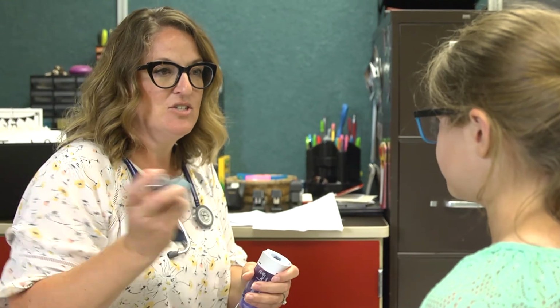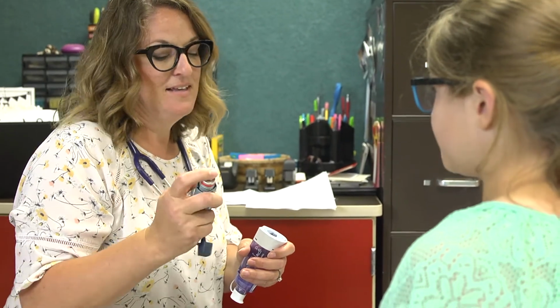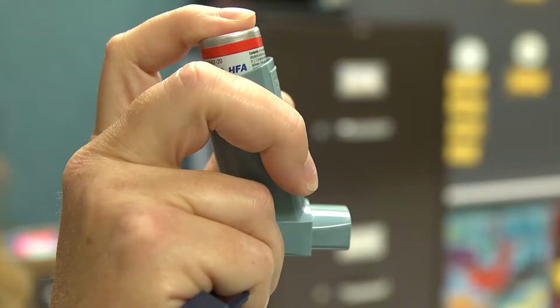Shake the inhaler for 10 seconds to mix the medicine. Remove the cap from the mouthpiece. Prime the inhaler if indicated.